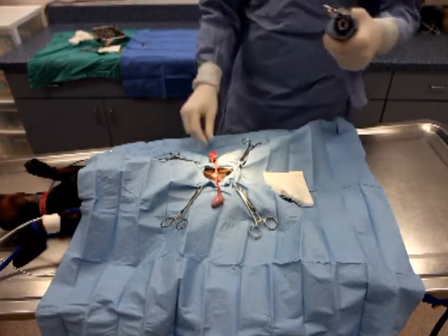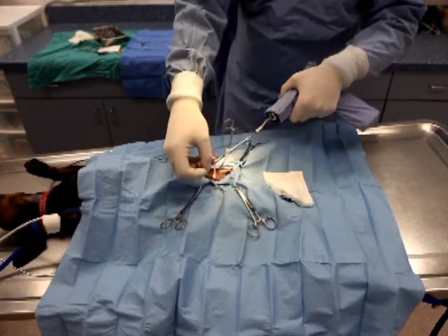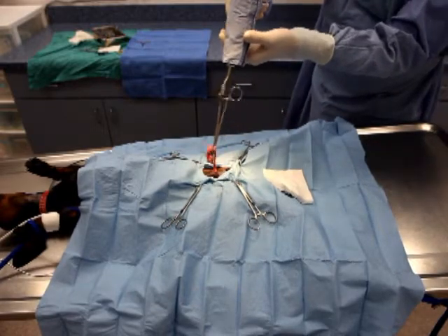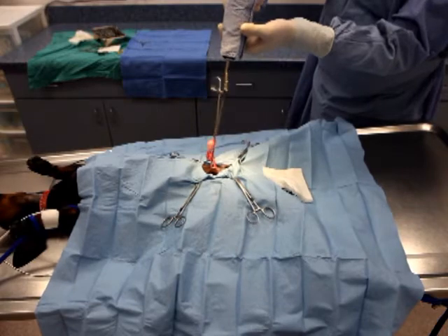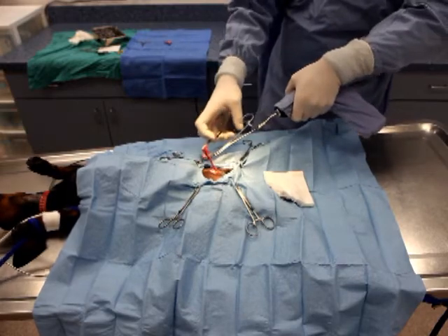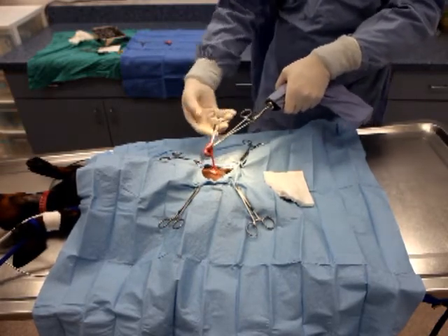Once both testicles are exteriorized, take the Jacobs Neuter Forcep and clamp it just below each testicle and apply slight back pressure, as this will ensure that the surgical drape and surrounding materials do not become entwined in the tool. If you have a variable speed drill, start slow and then slightly speed up until the spermatic cord severs.